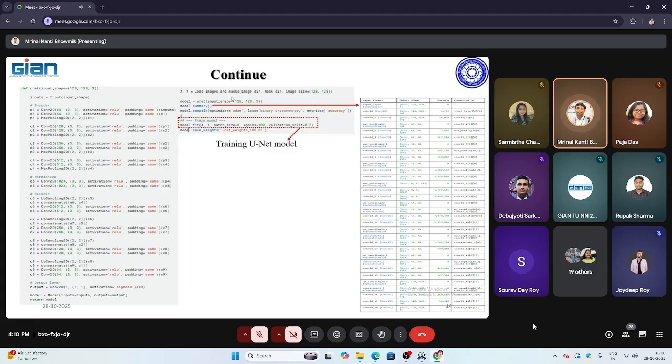Then after that I have considered 100 epochs sufficient, and it takes about 15 minutes to perform 100 epochs, and then the weights and model both got saved as a .h5 file, where .h5 represents a file format in which the model's information, its parameters and its weights have been saved.